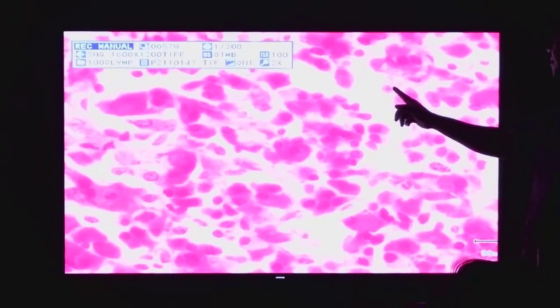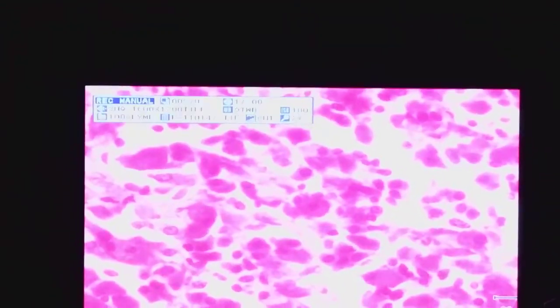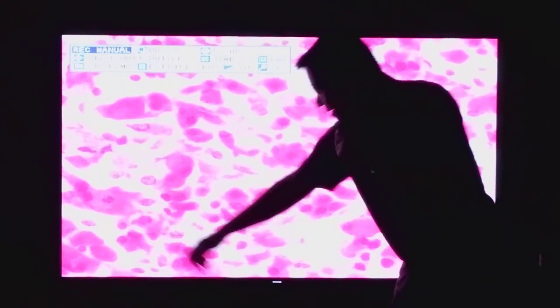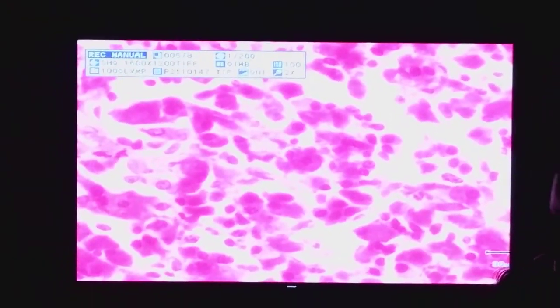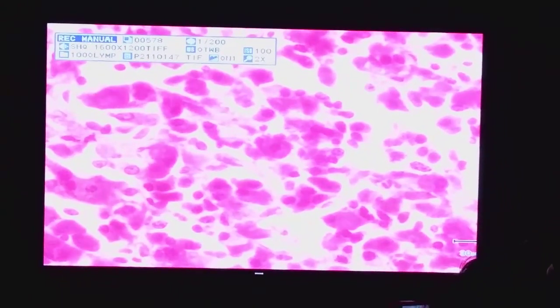You should be able to see also many capillaries. Among these spaces are the lumen of the capillaries. Even in the anterior pituitary gland or the pars distalis, you will be able to see numerous capillaries. What is the significance for the presence of the numerous capillaries? Okay, to receive the hormones, and to release the hormones.